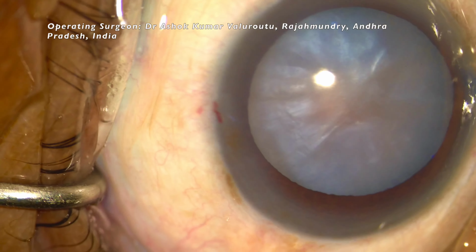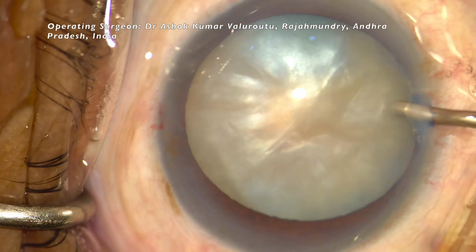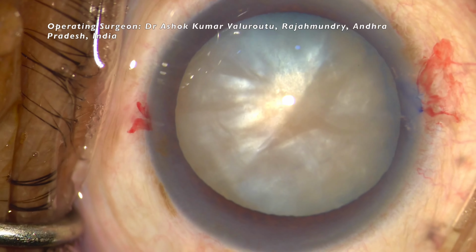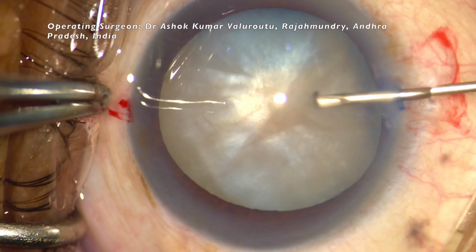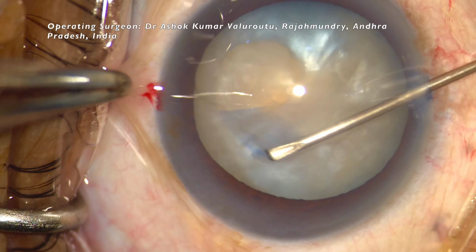In this case you could see the side ports are made, the anterior capsule is properly stained and the anterior chamber is properly infused with OVD, making the anterior chamber pressure higher than the intralenticular pressure.